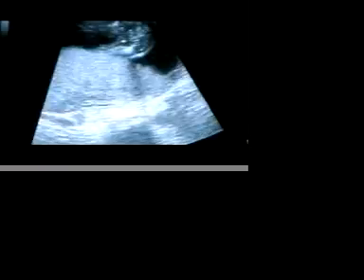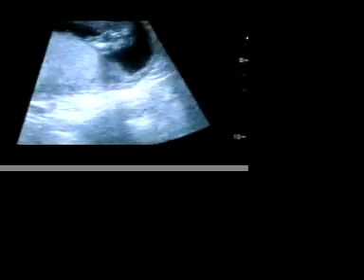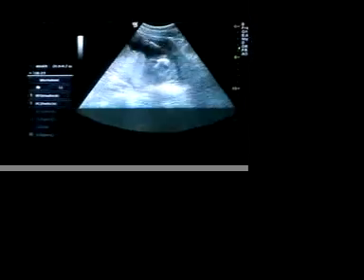Come on, sweetheart. But definitely not seeing anything that looks like scrotum. And usually just this maneuver will make the baby move. So I'd say 75% sure it's a girl. So baby's looking down towards your right buttock. Okay, sweetheart. There's an arm up there wiggling.